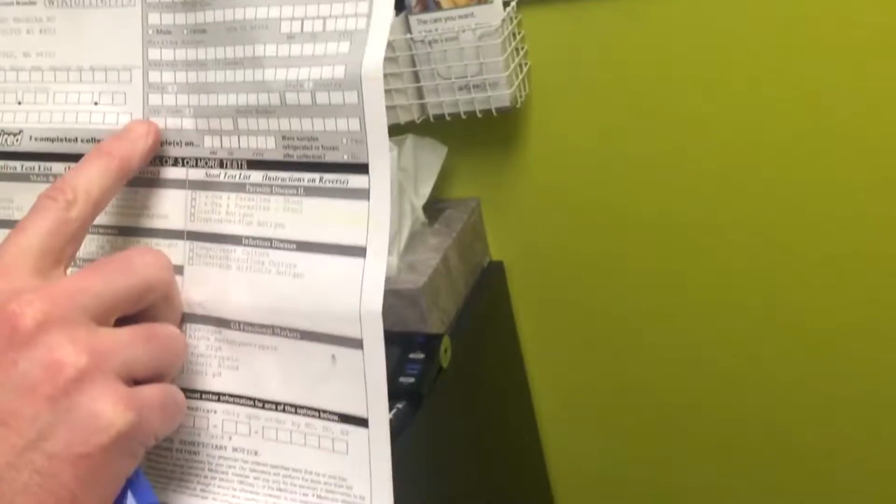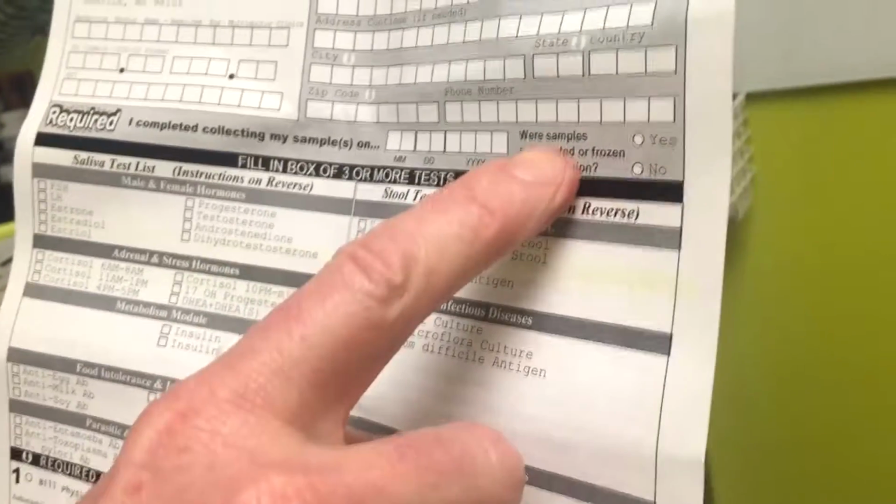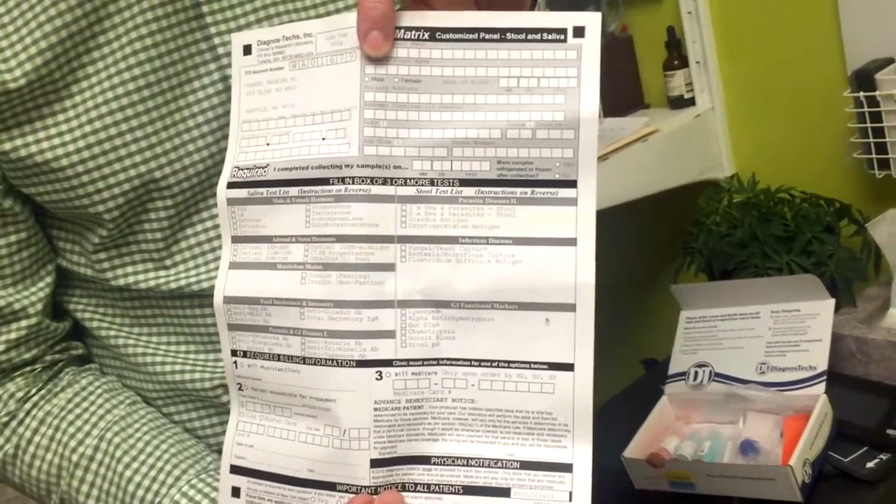On the opposite side here, I'm going to mark which tests are going to be run. But you need to put your last name, your first name, your sex, and your date of birth there. And then right here, I completed collecting my samples on the month, day, and year. And it's going to ask you were the samples refrigerated after collection, and you want to make sure you refrigerate them and answer yes. And then this is already paid for, so you don't need to worry about sending a payment with this.